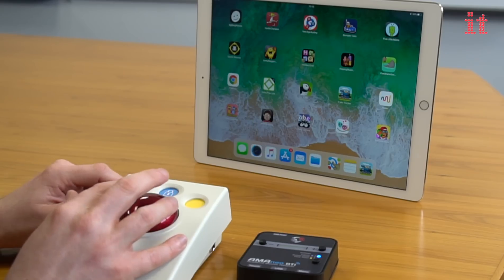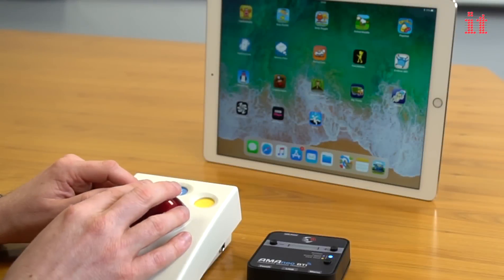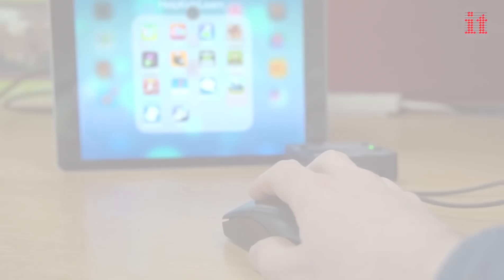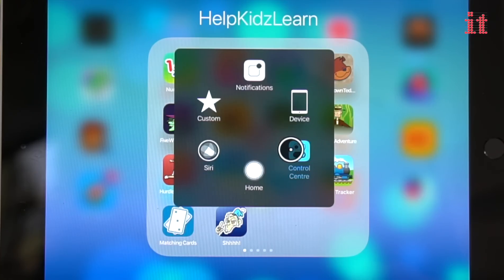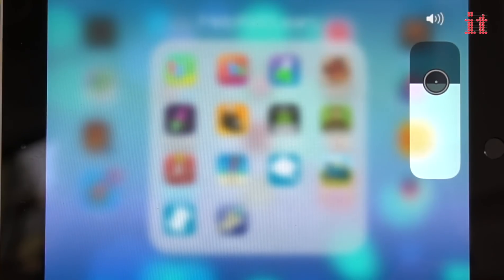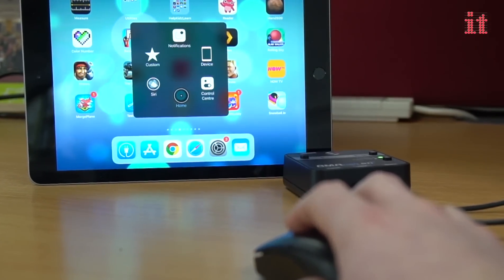Left click to open apps or a web browser, click and drag to move between screens, and right click to open the assistive touch menu, giving the user instant access to several iPad controls, including volume control, screen rotation and the home button.